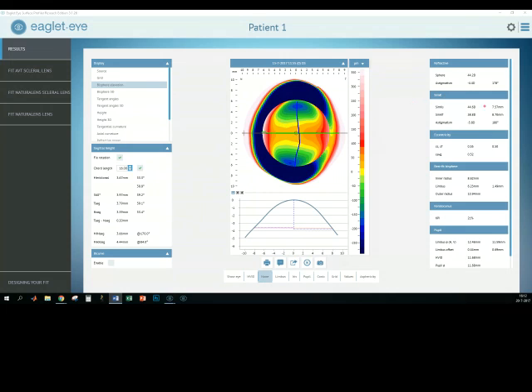So, we're looking at the K readings. You see that we have to deal with an eye with a very high astigmatism. Those eyes nowadays, we're going to sclerals quickly because they have much more reliable vision, much more stable during the day.